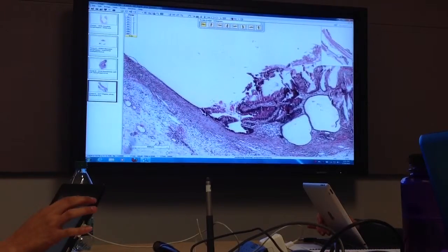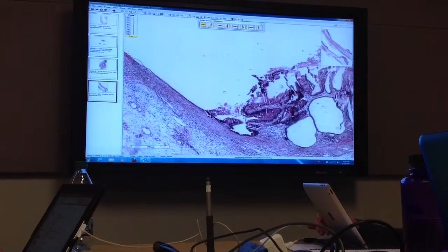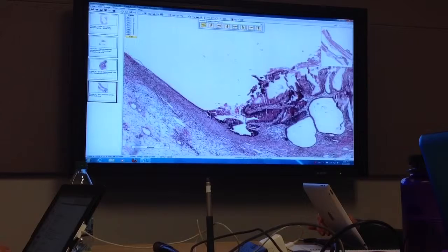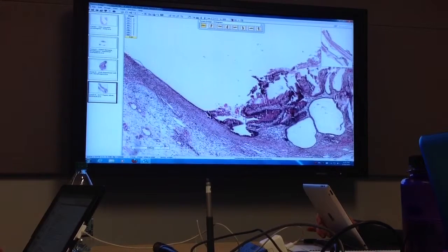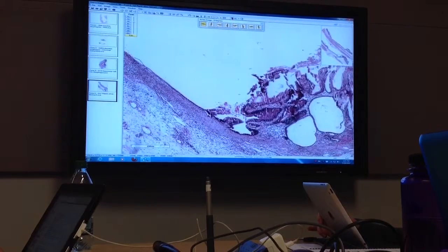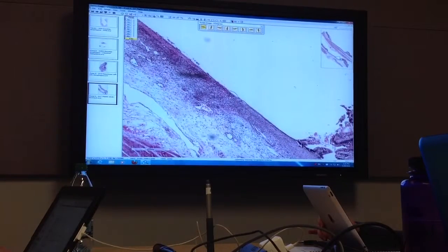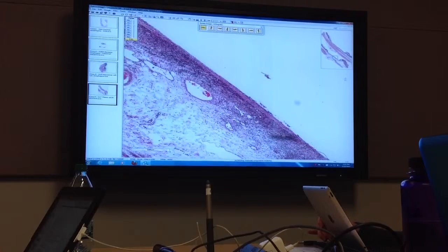So when you have an ulcer, this is kind of how it looks histologically. All the mucosa will be gone. The tissue at the edges of the ulcer will be very reactive appearing. See how these are kind of dark nuclei piled up? There's some inflammation throughout here, and these glands are dilated. And that makes sense, right? It's not going to be absolutely normal right next to an ulcer. So let's go a little bit higher and see what's going on.